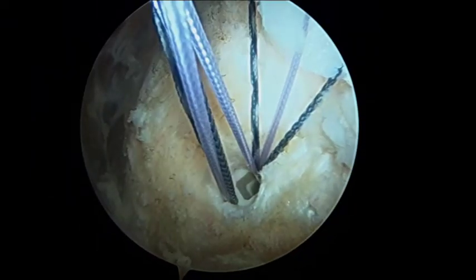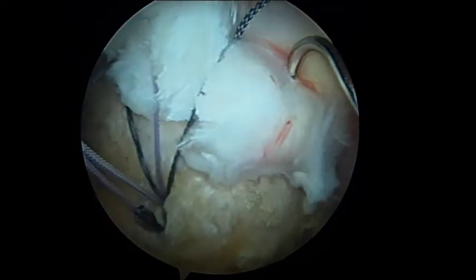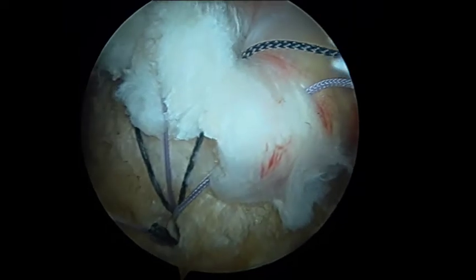Of note, at the surgeon's discretion, an additional suture can be incorporated into the lateral row anchor prior to its insertion. The suture can then be passed through the cuff tissue and tied with a simple knot to further reduce any cuff tissue to the footprint.